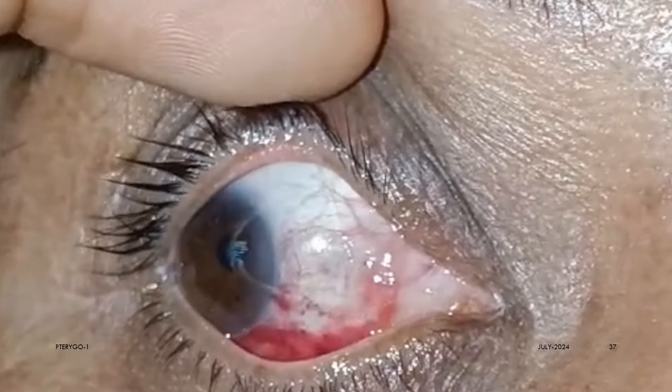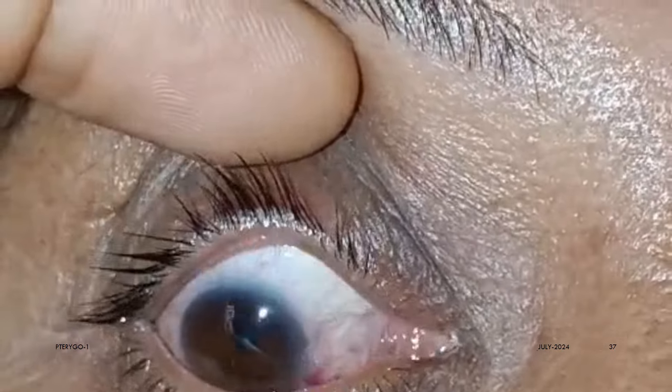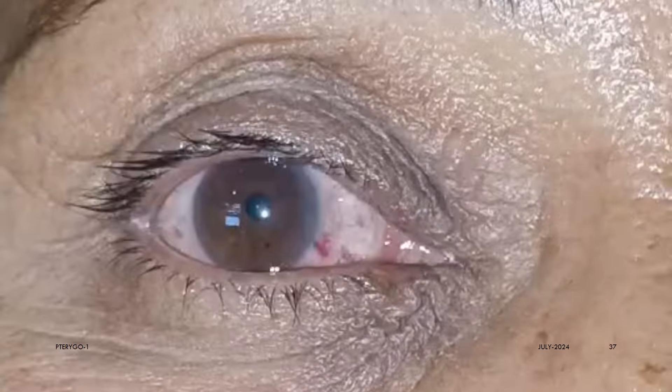This is the second day, 24 hours post-operative, and as we can see, the graft has already healed well and the lens is also in situ.